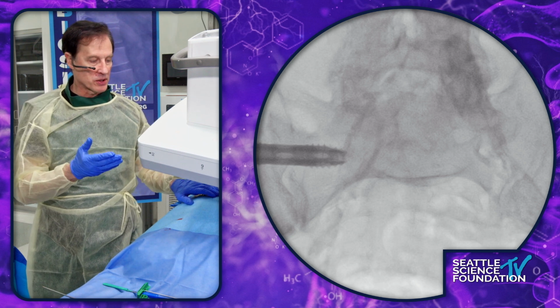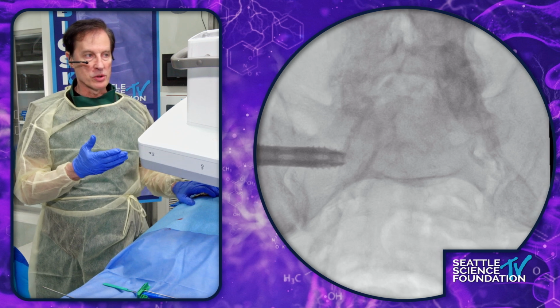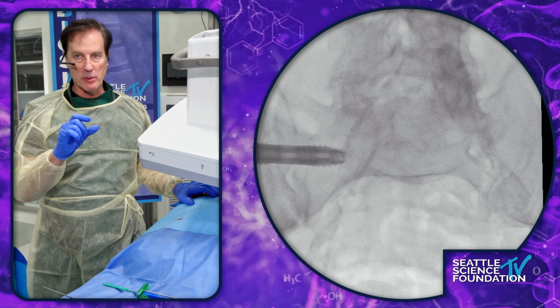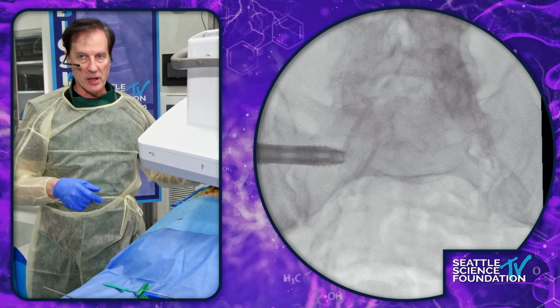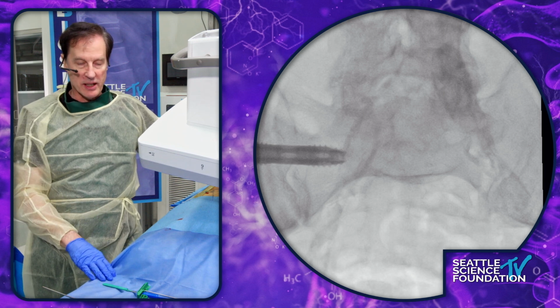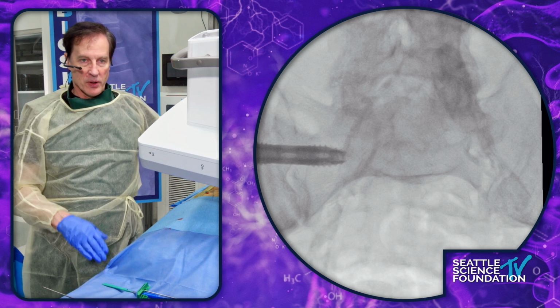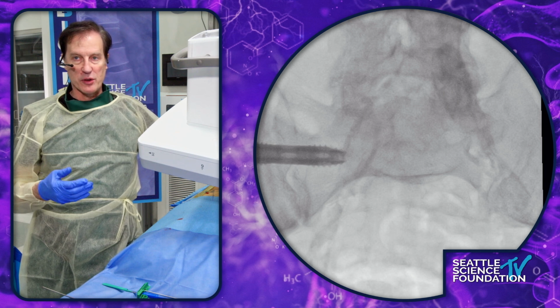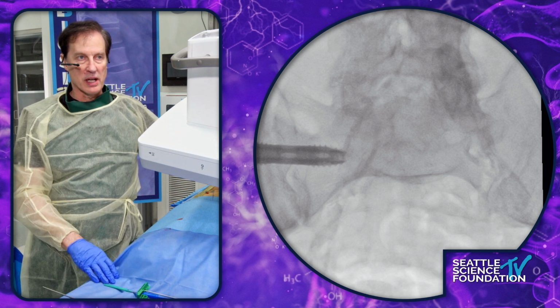So this is exactly the approach that you would use, 5 degrees off midline, and the iFuse-X are little small implants. Put a couple of implants in there. They're made out of cortical bone, and it goes right into the joint. I think that's ideal for very low demand, maybe elderly patients, and an in-office procedure is really ideal for that.